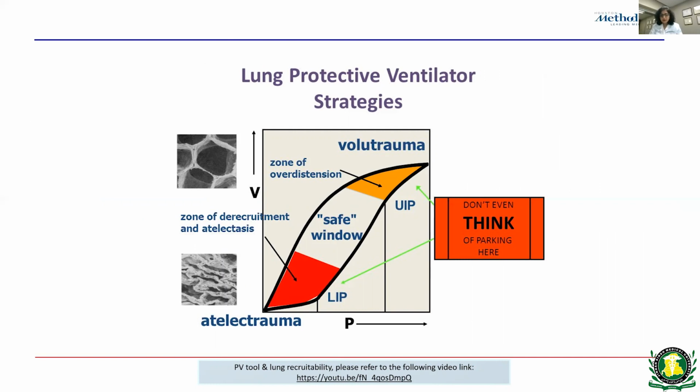This slide is going to go over the pressure volume loop, or the respiratory system compliance curve, that measures the static characteristics of a respiratory system. Classically, the curve is measured at 0 PEEP, forming a sigmoid shape because of lung recruitment at low pressure volume and hyperinflation at high pressure volume. In other words, at low pressure volume, there is the lower inflection point, or LIP, created by alveolar opening pressure.